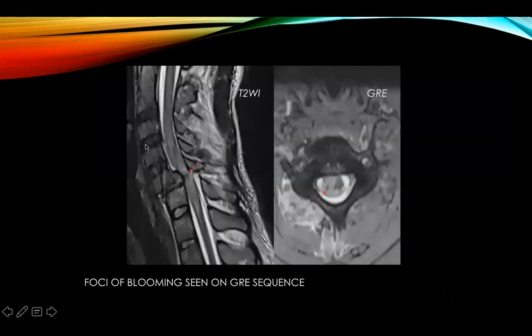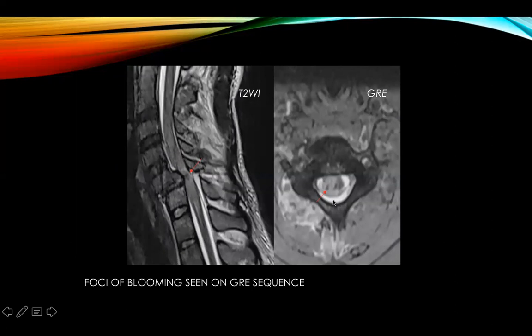This is another case of fracture dislocation of the C5 vertebra with disruption of all three columns of the ligaments. There is hypointensity within the cord surrounded by hyperintensity, suggestive of hemorrhage, which was confirmed on the GRE sequence as foci of blooming, as pointed by the red arrows.